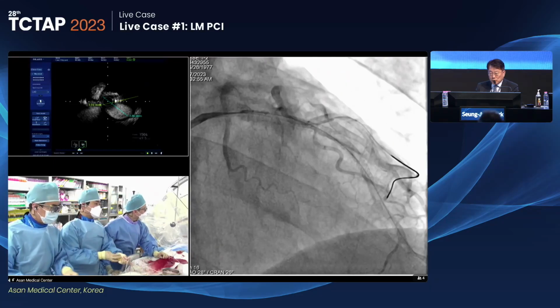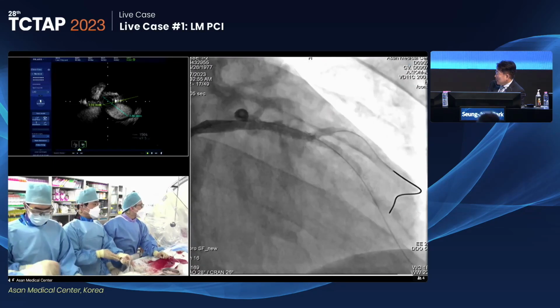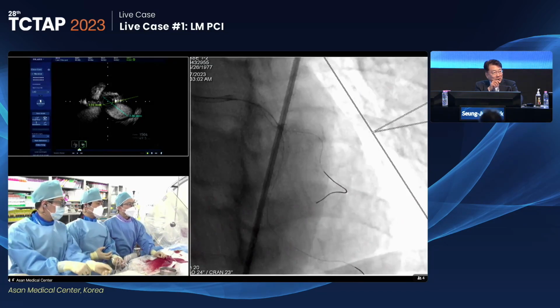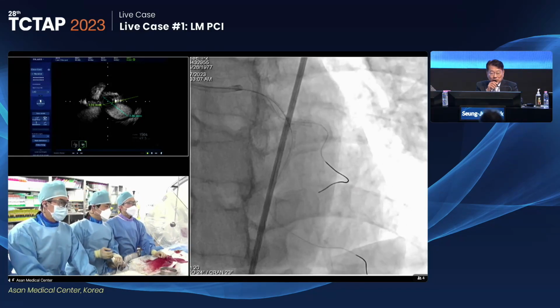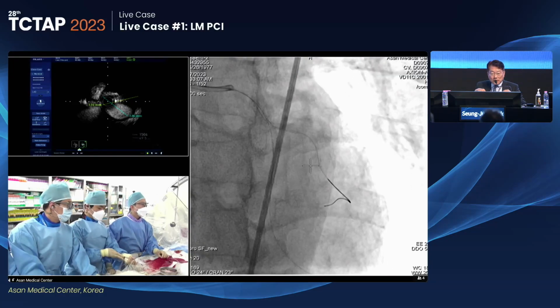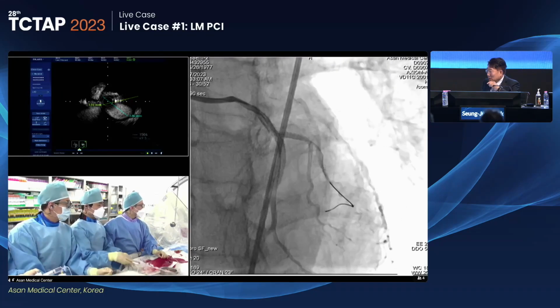Great. Looks good. It's always good, right? Yeah. Dr. Kang, really thank you for a nice presentation. We want to see the final result later. Dr. Colombo would like to look at something.